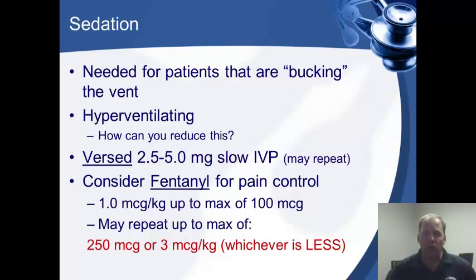Especially for obstructed patients, they need a chance to rest. And their problem was a disease of ventilation. They probably just got tired of trying to move so much air and not being able to expire. Sedation gives them a chance to relax, comply with the vent settings, and it'll keep them from hyperventilating should they try to overbreathe the vent. Keep in mind your protocols.